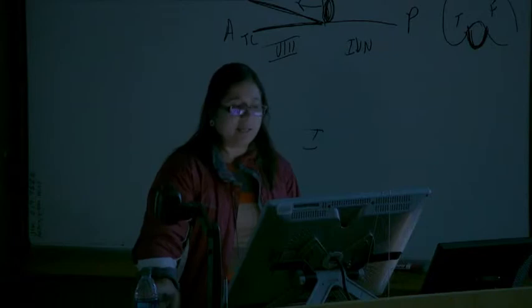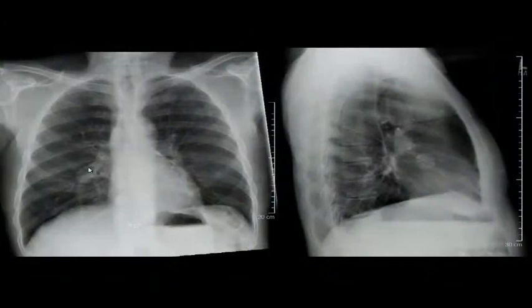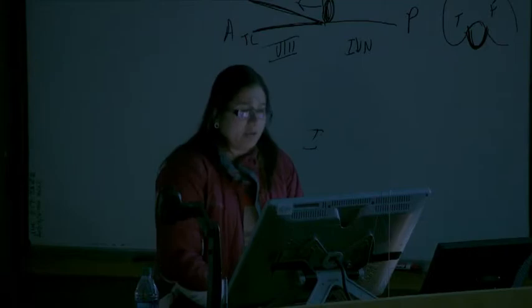What about the lateral? Lateral, circumscribed oval lesion. All right. Differential diagnosis, please. Right now, it's a wide open field. I haven't shown you a CT. I haven't given you any history. So you can start with lymph node, AVM, things like that. Since it's wide open right now. A central mass, right? Okay.